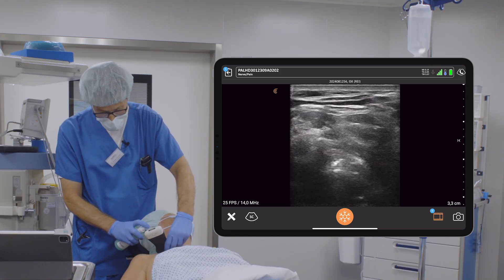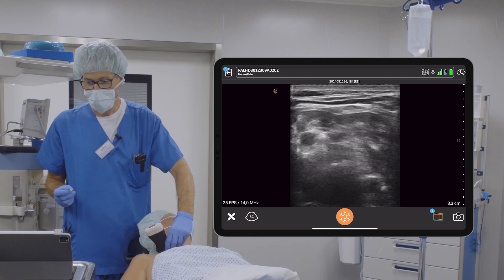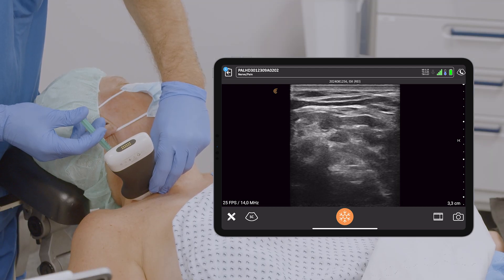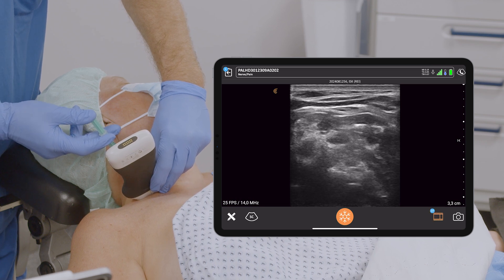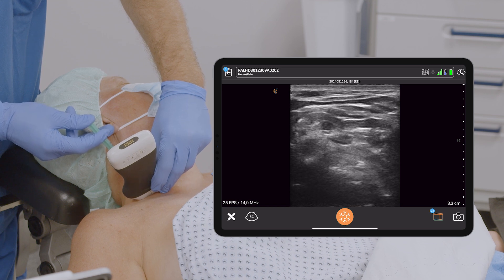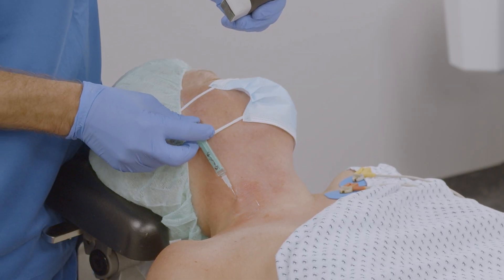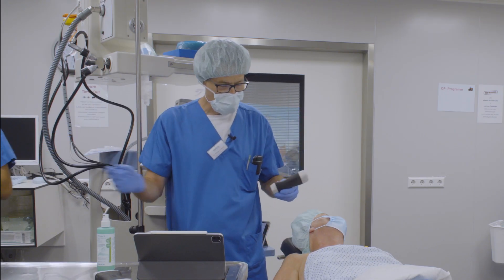It will be cold for you. I keep my distance between the needle and the probe for sterility and hygiene reasons. And now I inject a little bit and split all the horizontal fascia layers. Then I take the probe off, go subcutaneously and tunnel subcutaneously in the direction where the catheter will be inserted.